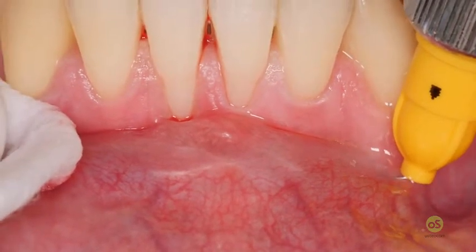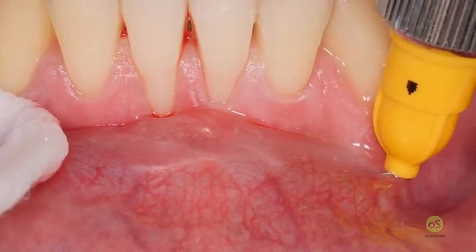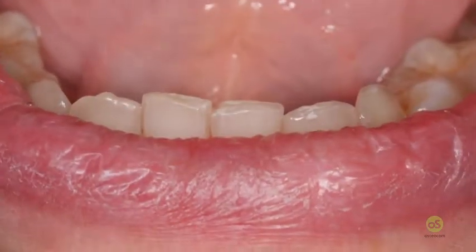That is done exactly in the same way I showed you before, so I don't show you now, because in this way I don't have to change the position of the camera, but I will show you during the harvesting procedure.